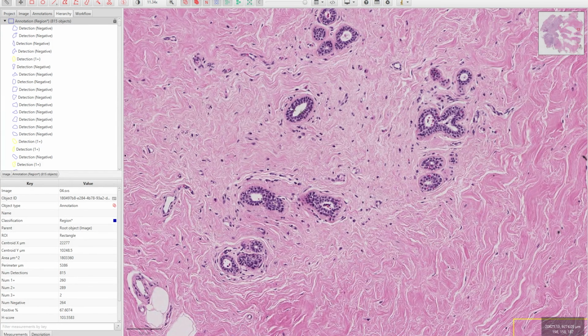Now let's move to another tool called fast cell counts, and it provides a rapid automated method to estimate the number of cells, typically the nuclei, in a selected region without performing full segmentation or detailed morphological analysis. This tool is optimized for speed and efficiency, making it ideal for quick assessments or large datasets where high precision is less critical than throughput. While less detailed than the standard cell detection tool, this tool offers a practical balance between performance and accuracy for preliminary screening or resource-limited scenarios.